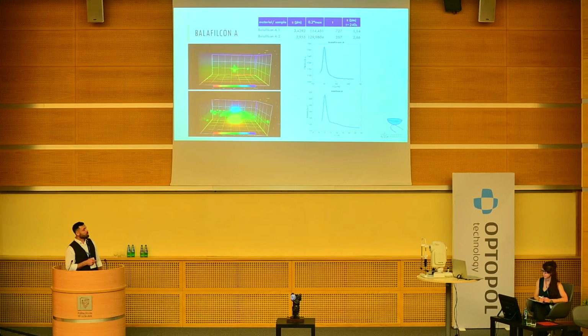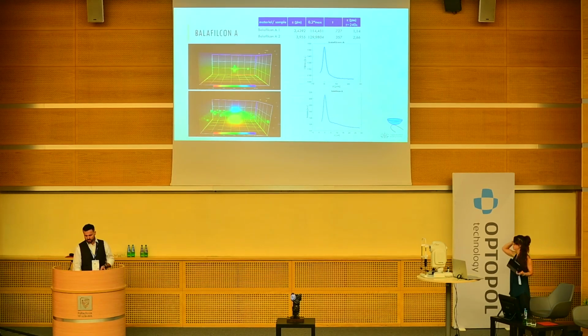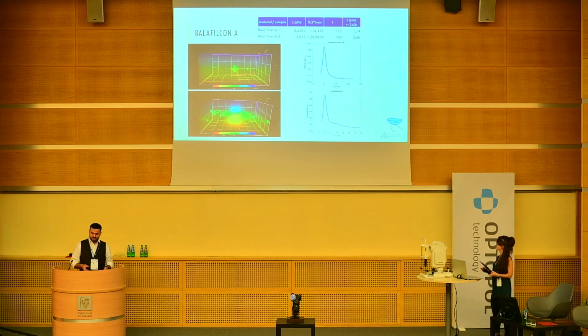And we also checked how much time it took from the lipid attachment to the lens surface to the end of this visualization, to taking these measurements. So with that, it was possible to make some kind of calculation to look at how these lipids diffuse in the same amount of time.